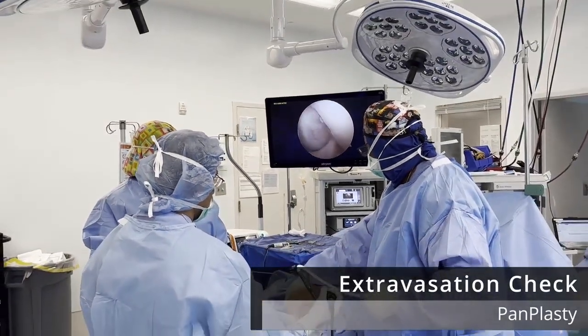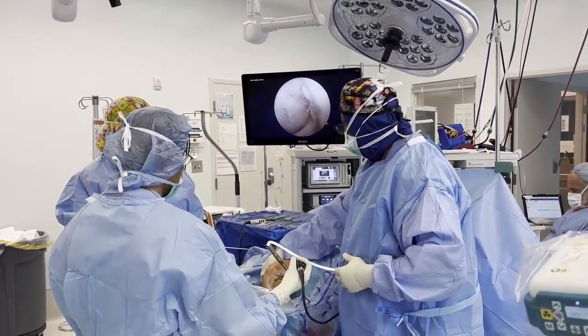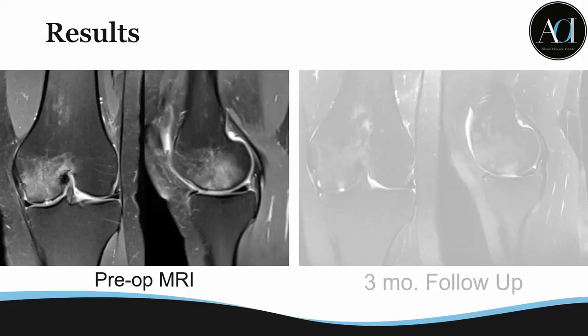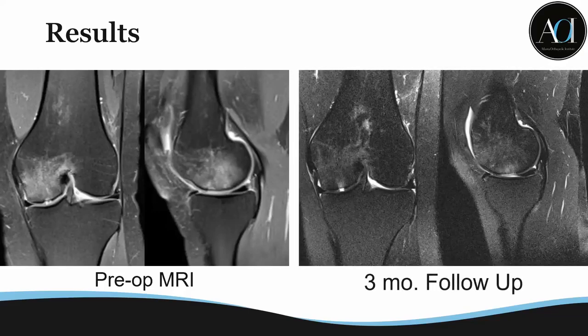Finally, repeat arthroscopy is performed to check for extravasation and complete the procedure as necessary. Here's the follow-up evaluation of the case presented, demonstrating significant improvement on MRI and clinical resolution of symptoms.